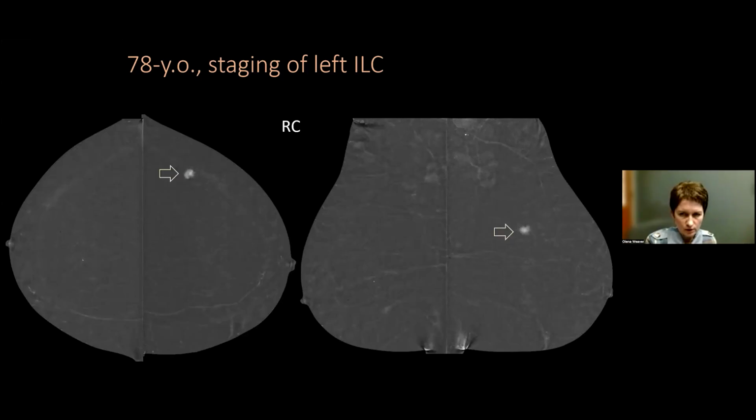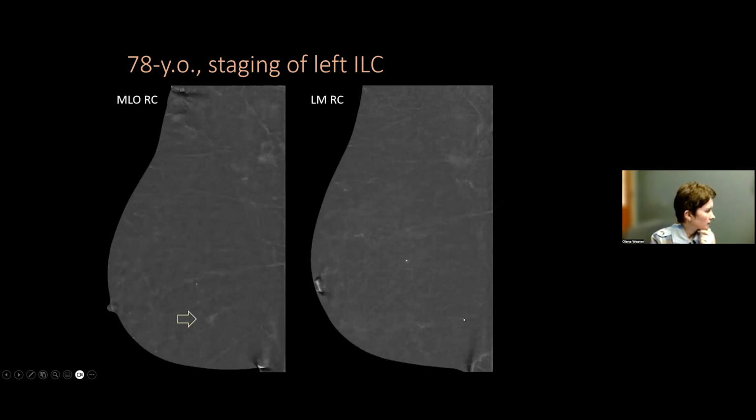So we do know that this is an invasive lobular cancer. What we do need to deal often with when we're doing contrast enhanced mammography is a little incidental findings. Like in this case on the right, you can see a little area of maybe focal enhancement, even though it's only on one view. It was not seen on the lateral medial recombined images. So you remember that you can do additional views with CEM. You can do lateral views. You can do spot compression views if you want.